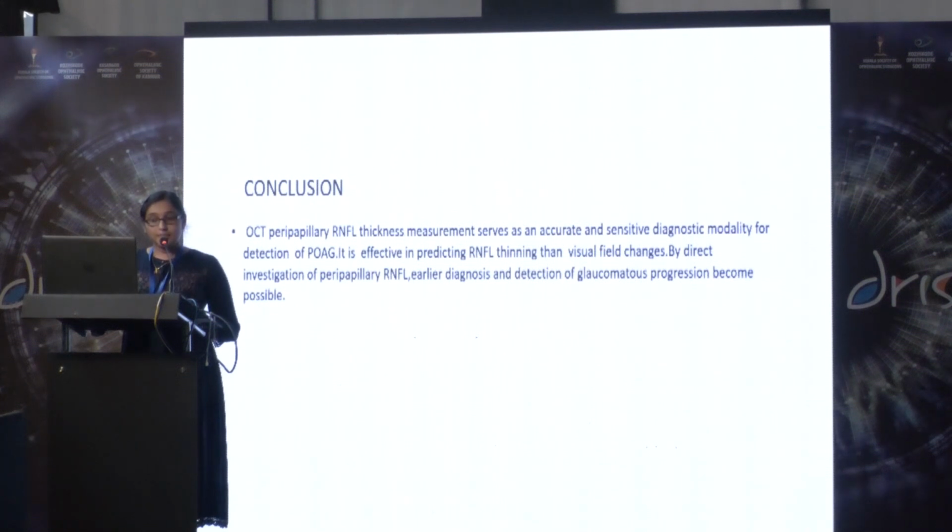Conclusion. OCT peripapillary RNFL thickness measurement serves as an accurate and sensitive diagnostic modality for detection of POAG. It is effective in predicting RNFL thinning earlier than visual field changes. By direct investigation of peripapillary RNFL, early diagnosis and detection of glaucomatous progression become possible.